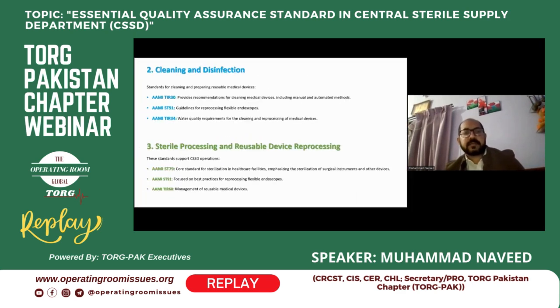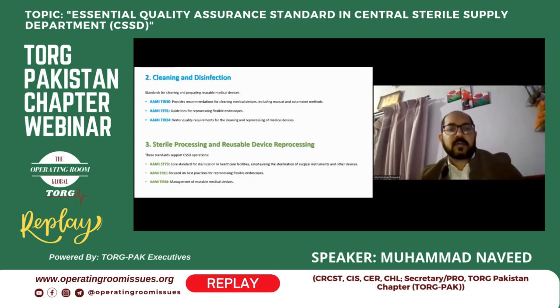ST79, I told you about this one, is the core standard for sterilization in healthcare facilities, emphasizing the sterilization of surgical instruments and other devices. ST91 focuses on best practices for the reprocessing of flexible endoscopes, and TIR 68 covers the management of reusable medical devices.